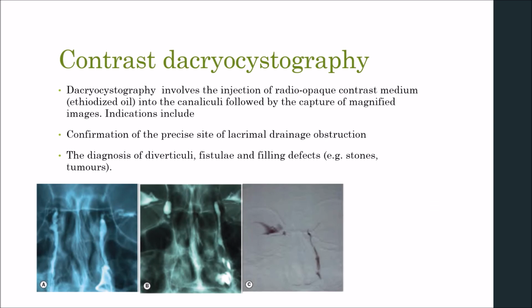Next test we are going to discuss is contrast dacryocystography. Dacryocystography involves the injection of radio-opaque contrast medium, which is iodized oil, into the canaliculi, followed by capture of magnified images. Indications include confirmation of the precise site of the lacrimal drainage obstruction, to guide surgery, and the diagnosis of diverticuli, fistulae, and the filling defects, for example, stones and tumors.